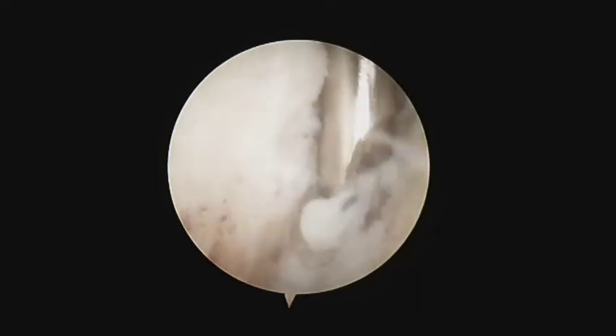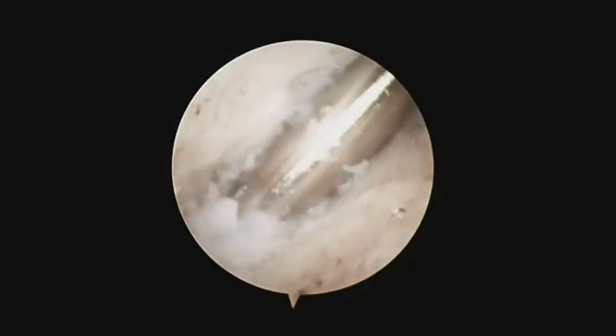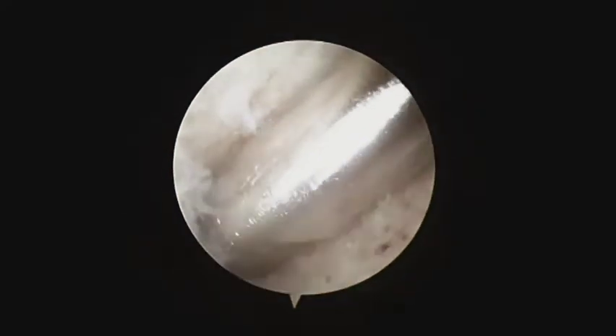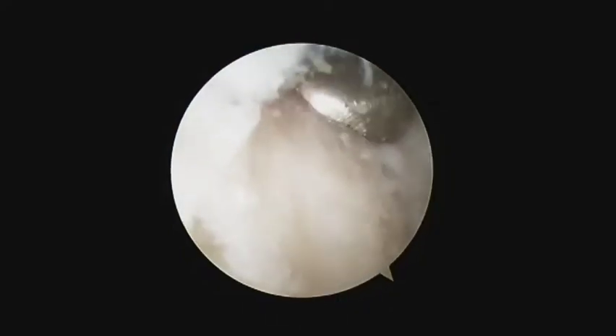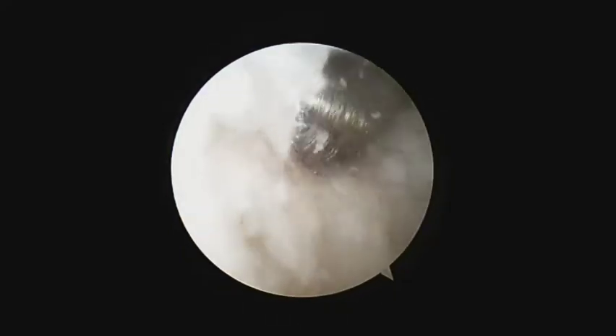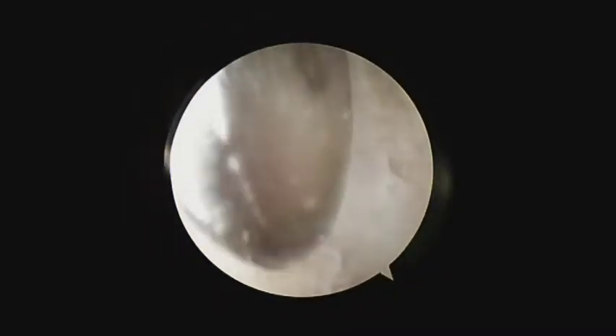The synchondrosis is debrided to expose the bone surfaces of the accessory navicular and the navicular bones. The next step is clearance of the bone surfaces by means of an arthroscopic curette, a small periosteal elevator, or an arthroscopic osteotome.